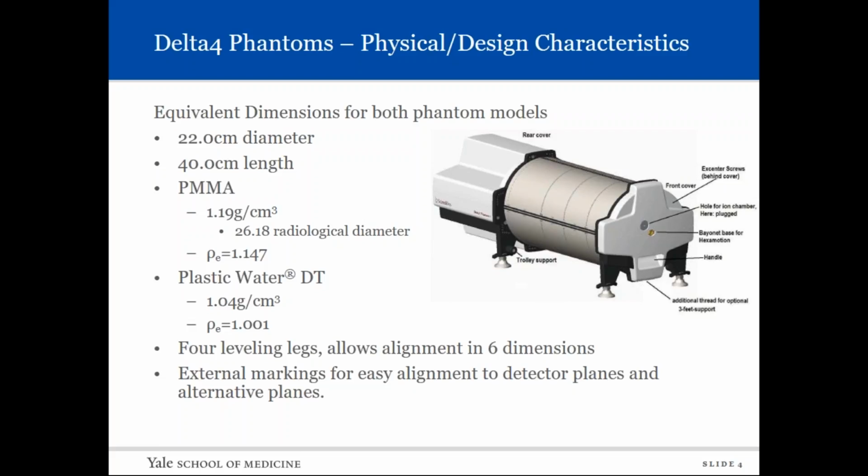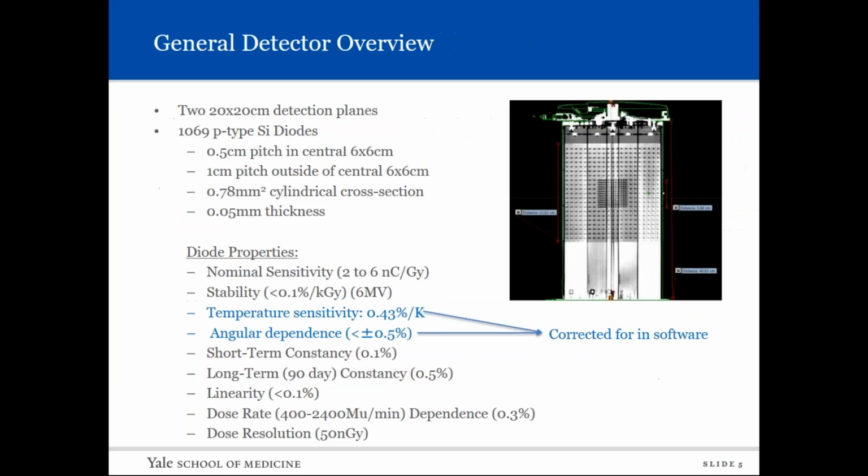Each Phantom is quartered to allow for insertion of 2 planes of diode arrays, and then there's also just leveling legs and external markings that allow for easy alignment in 6 dimensions. That's just the physical characteristics of it.